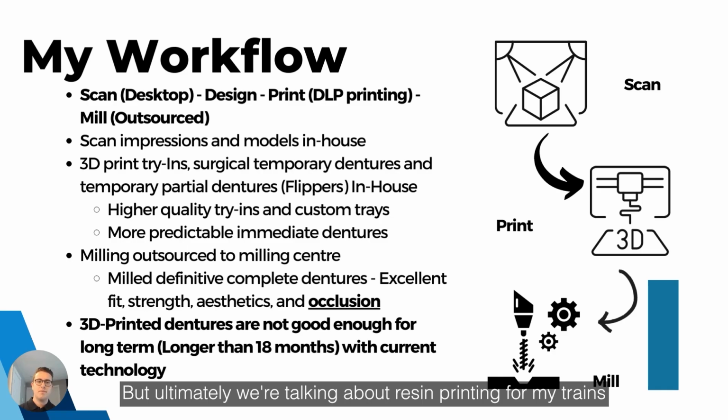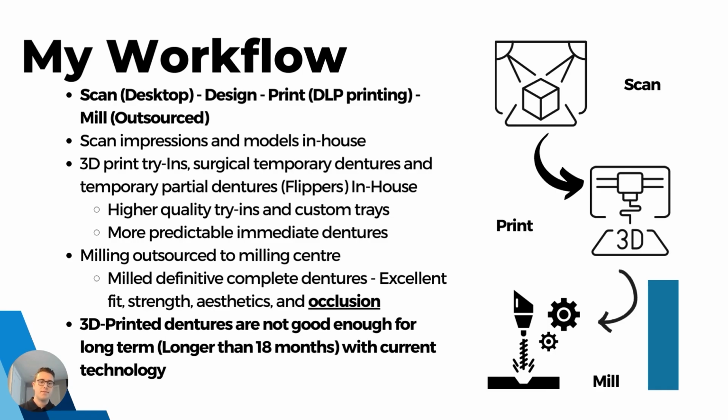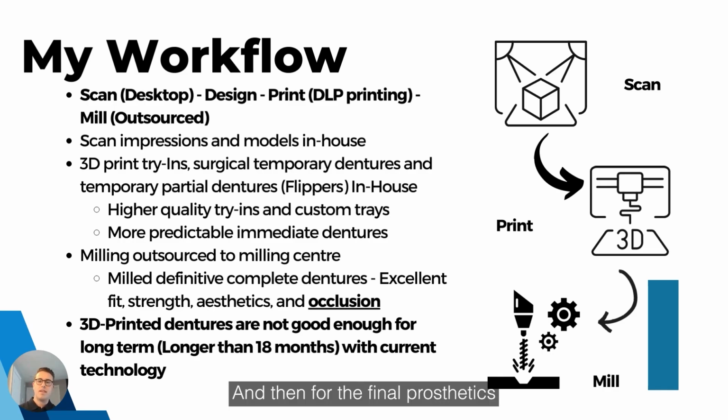But ultimately, we're talking about resin printing for my try-ins, and resin printing for my surgical dentures, and resin printing for my temporary partials. And then for the final prosthetics, everything is getting milled out of PMMA.